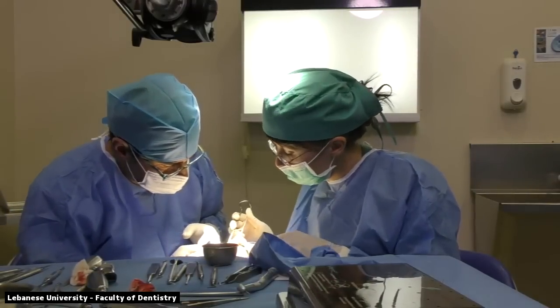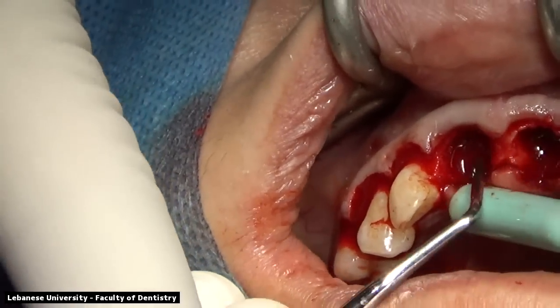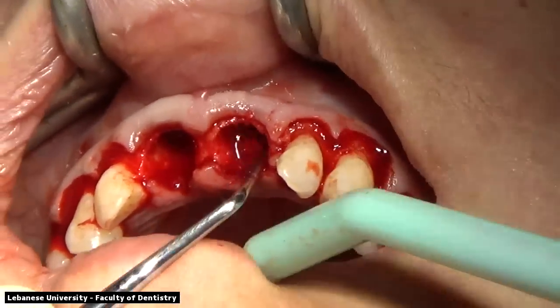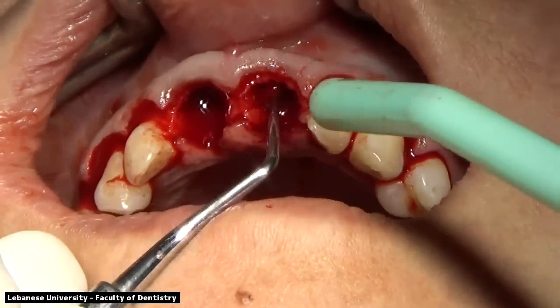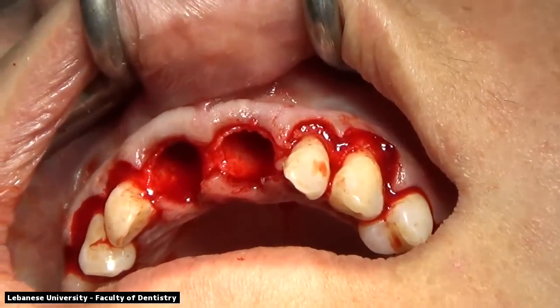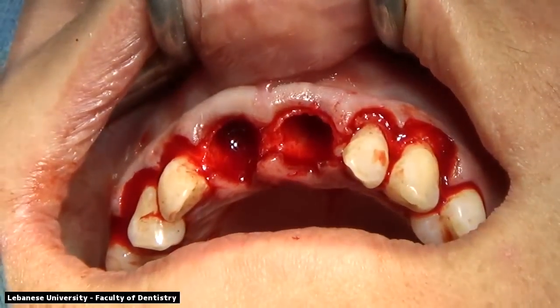We are going into the sockets, and we're doing some curetting of the socket so that we can remove the granulation tissue that was present because of the periapical infection on the site. We're making sure that there is no granulation tissue present and that the walls are intact. We can hear the bone on both the right and the left central sockets. This will indicate that there is no granulation tissue remaining and will allow us to start with the implant drilling sequences.